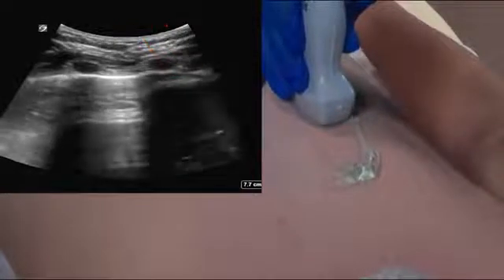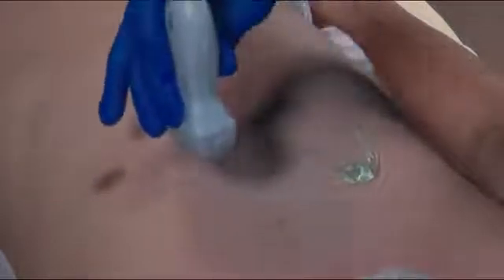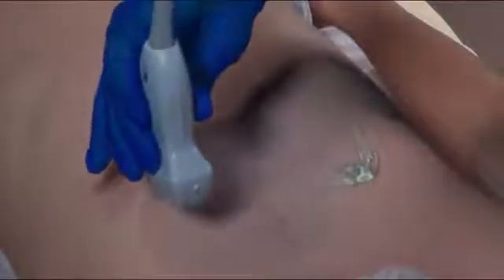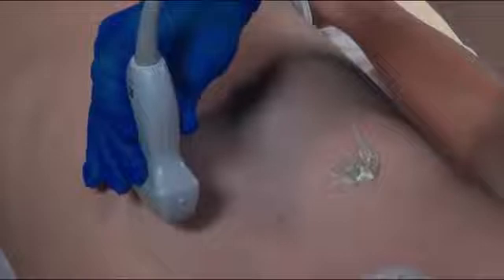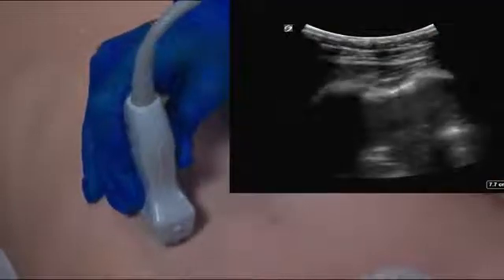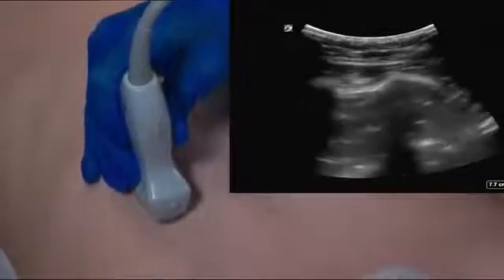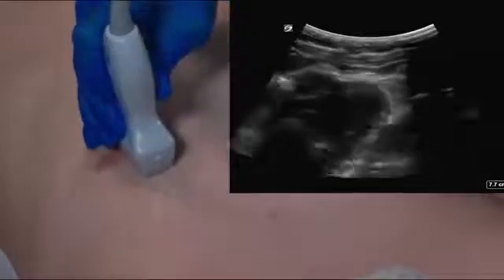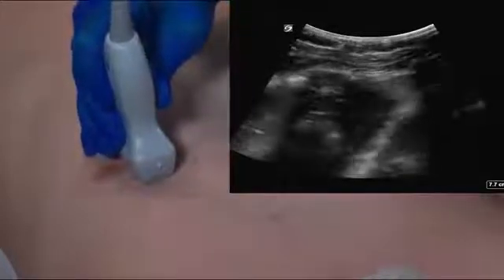After we've done this on the right side, we're going to repeat the procedure on the left. Again, in the mid-clavicular line just above the nipple, we're going to place the transducer down and drag it several centimeters until we're just below the nipple.